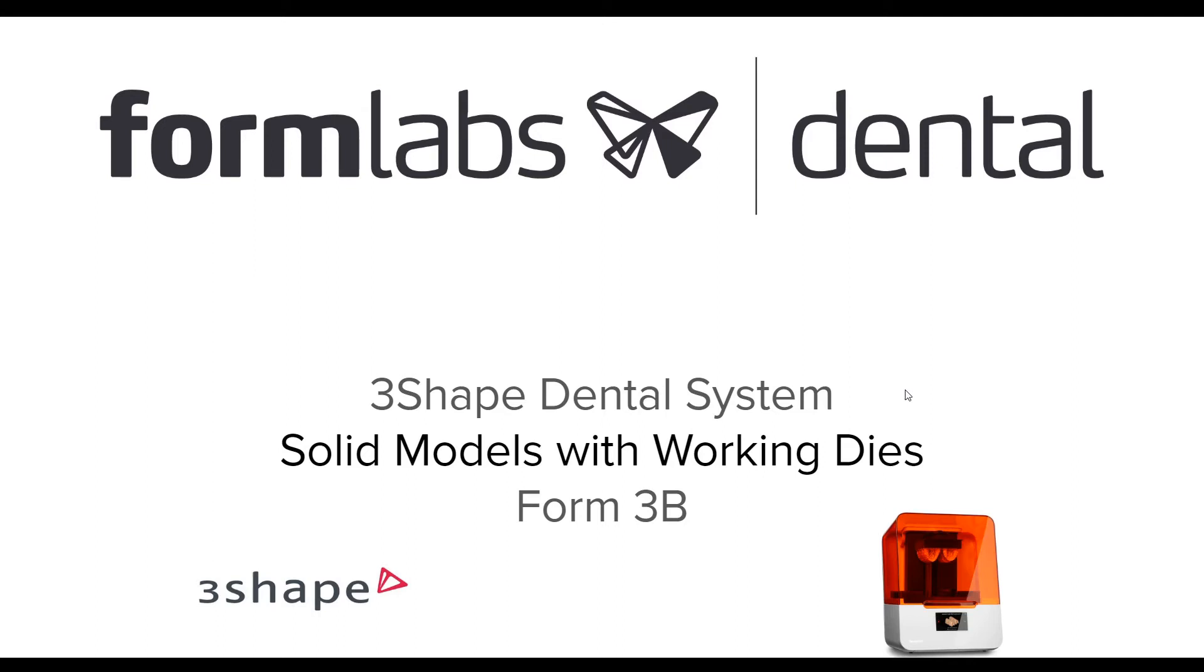Hello, this is Sam from Formlabs Dental. In this video I'm going to show you how to build solid models with working dies using 3shape dental system for the Form 3B 3D printer from Formlabs.